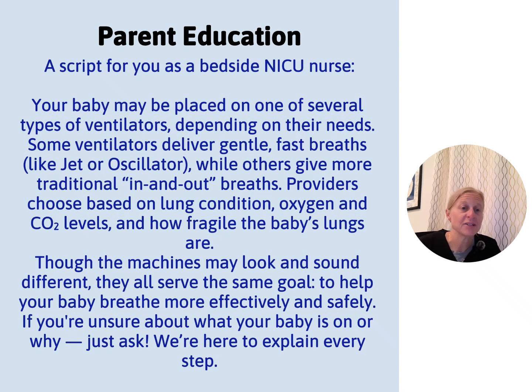It's also reassuring to say, hey, if you're talking to them on the phone, your baby is on the conventional ventilator and we may need to bring in a ventilator called the jet. It doesn't mean that your baby is on a last piece of equipment that we've ever had. It just means this is what your baby needs right now to help them. And we have the resource and this is what we're going to use. I think sometimes when we go on a different ventilator, we see it as a step back when maybe it's just an equal movement, but we need to achieve a different goal. And so that's what I like to impress upon them.